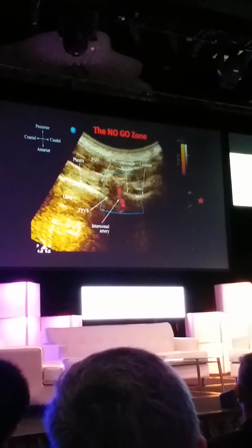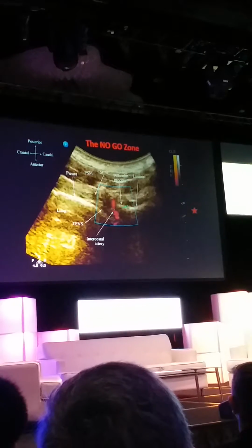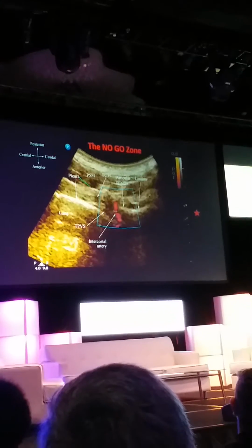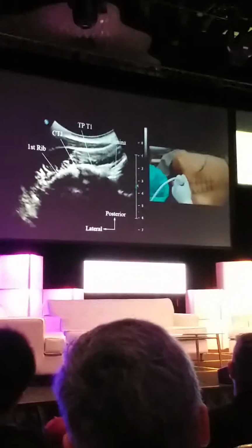So we still place our needle in the lateral aspect of this triangle, like Dr. Shibata or the group from Pittsburgh. But now, because we can visualize this entire triangle, we believe you can get a better visualization when injecting. Inserting the needle close to this area carries the danger of intravascular injection, and also injection into the dural sleeves. Fortunately, none of them have been reported so far.